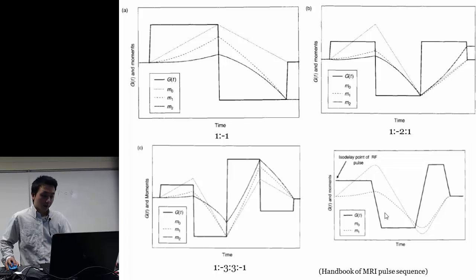Also, practically speaking, it's difficult to find spins with a constant acceleration rate in the body, because even though the heart is beating, the acceleration goes back and forth from positive to negative. So it's not realistic to do compensation on the acceleration effect.